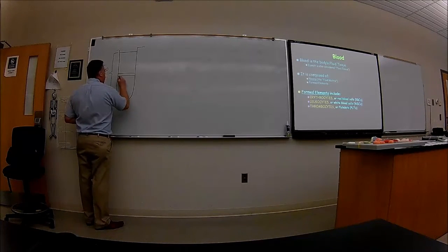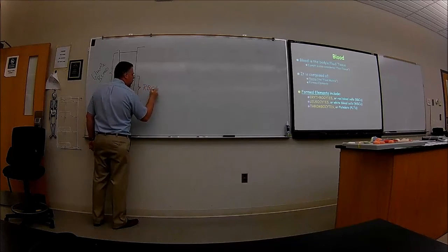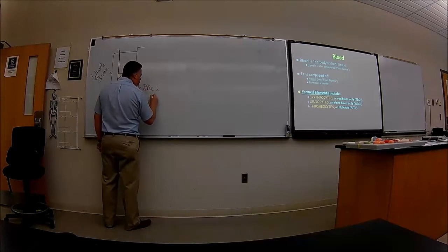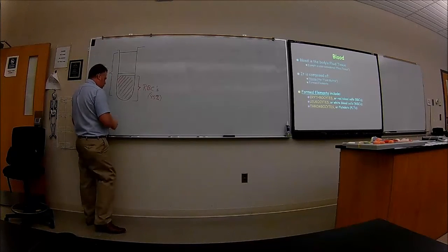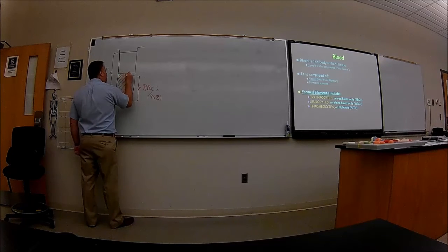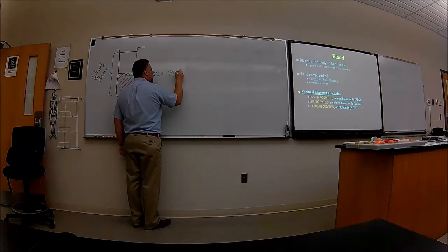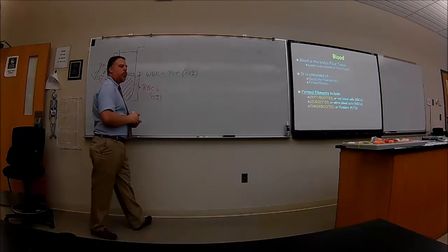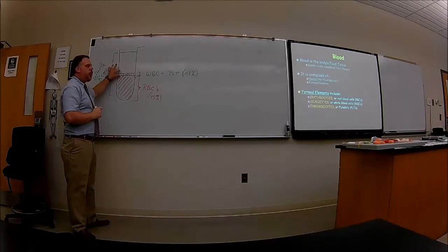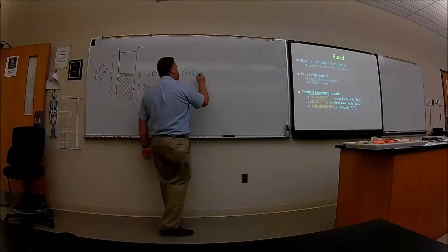The heavy stuff down here is going to be your red blood cells, and that makes up about 45% of your whole blood. In this very small area that looks kind of beige in color, this is where you're going to have both the white blood cells and the platelets. This makes up less than 1% of your whole blood. This area looks very beige. And for your vampire lovers out there, we have a special name for this called the buffy coat or the buffy layer.